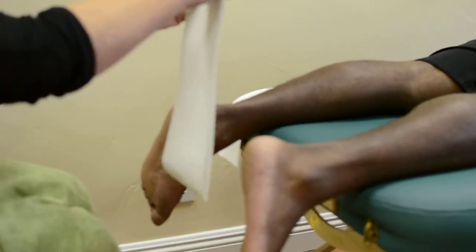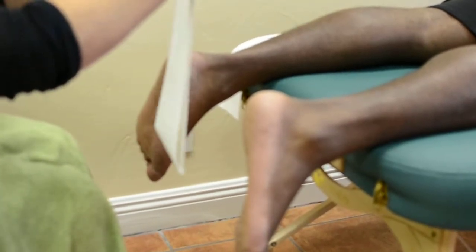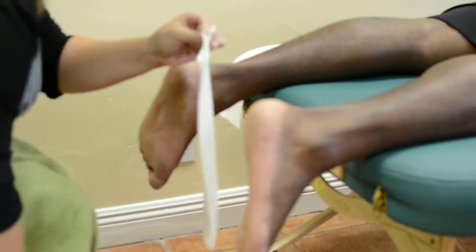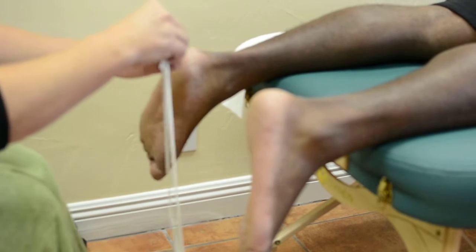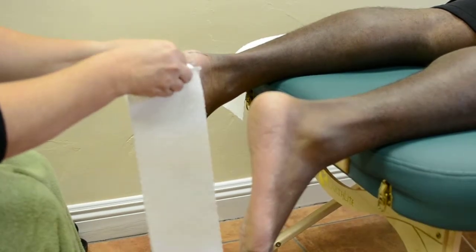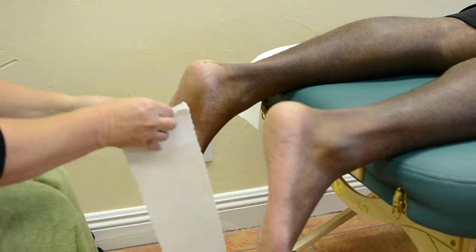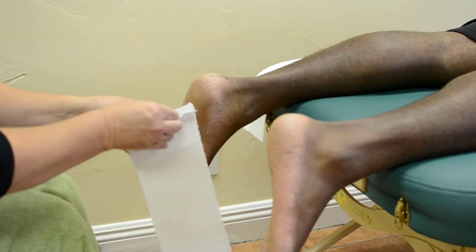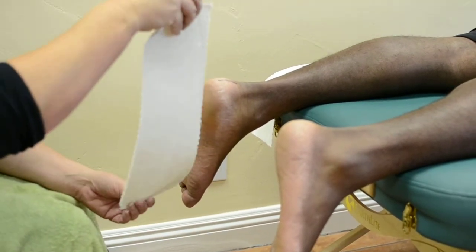Okay. Here we are at the Laser Med Sports Spine and Neuropathy Institute, and we are plaster casting DJ's functional specific orthotics, and he's developed some foot dysfunction. So these orthotics are going to get not only his feet but his whole upper body into proper alignment.